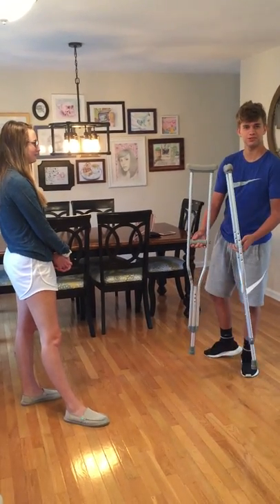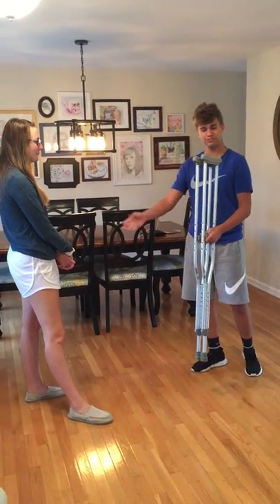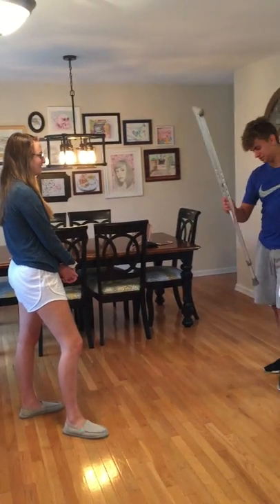Hello. Today I'll be fitting these crutches for my patient, Hope. Hope, how tall are you? 5'7".